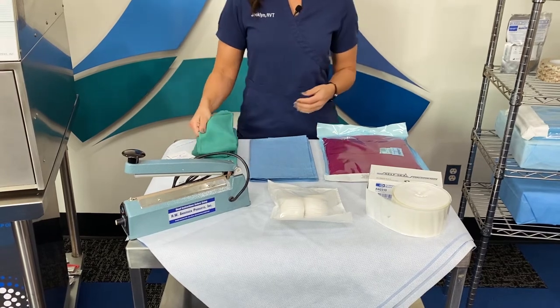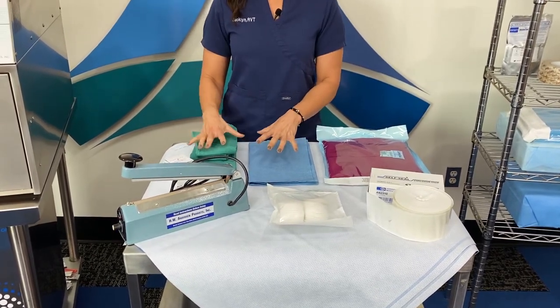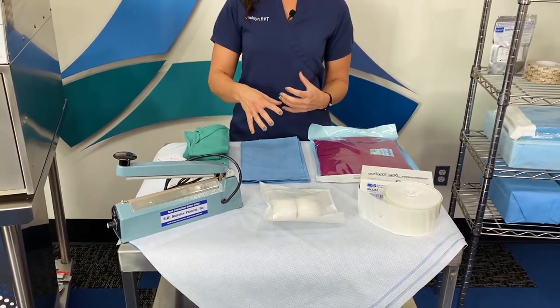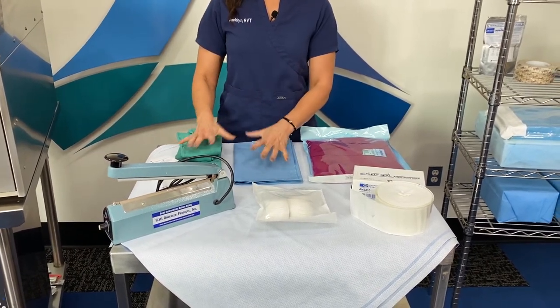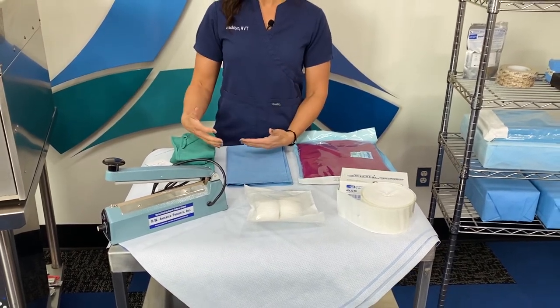And then also drape material, so the cloth. These two you're generally double wrapping, so consider that. Also consider your cycle time with the materials that you're wrapping and how you're sorting those things. With these, you wrap them like a package — there's not an adhesive seal. So these would be 30-day shelf life.